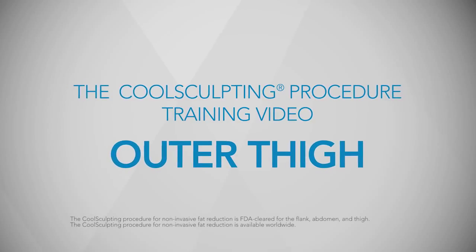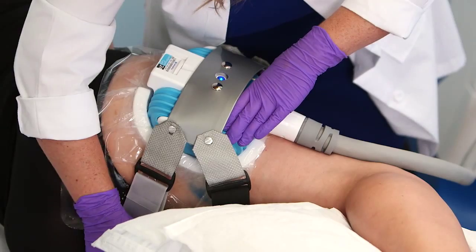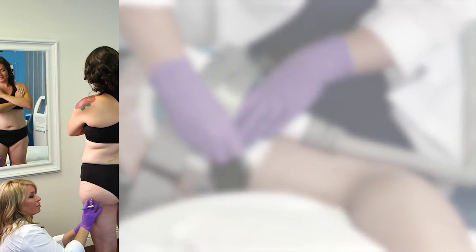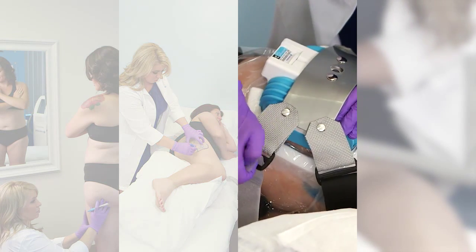In this CoolSculpting procedure training video, we will discuss how to use the CoolSmooth applicator on the outer thigh. Topics include how to assess the outer thigh, plan the treatment with markings, and place the applicator.